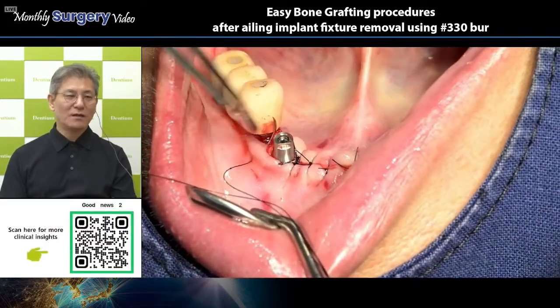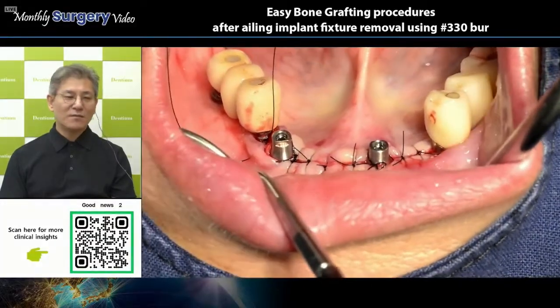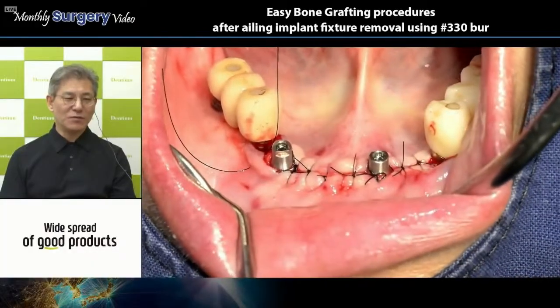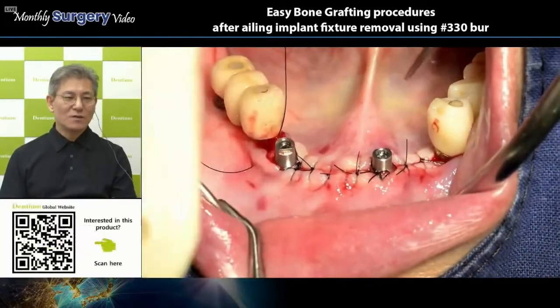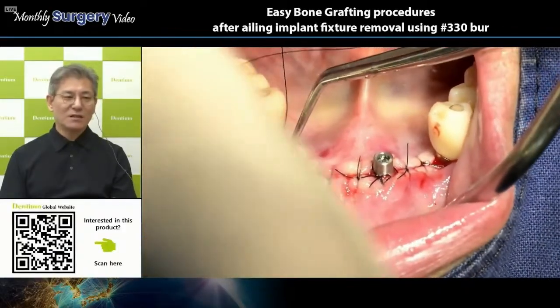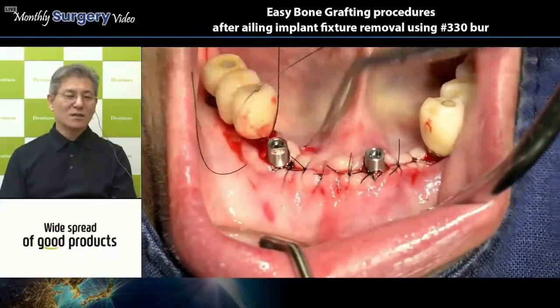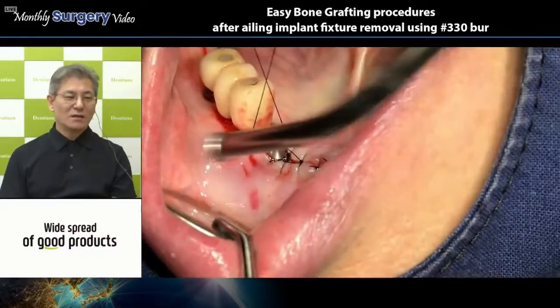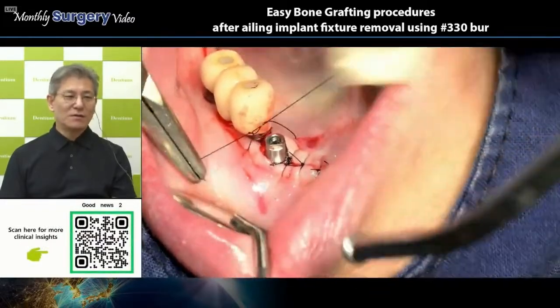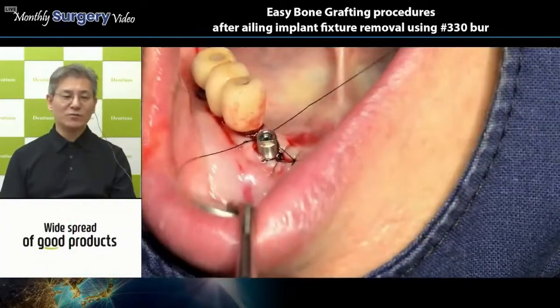With a simpler way, and a good implant system like Bright TL, implant surgery is simpler than before, and it doesn't need the big periosteal releasing incision anymore, because the open healing technique is available using this collagen graft, a brand new regeneration material.